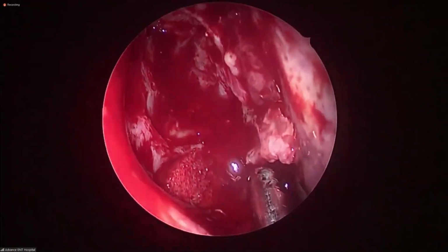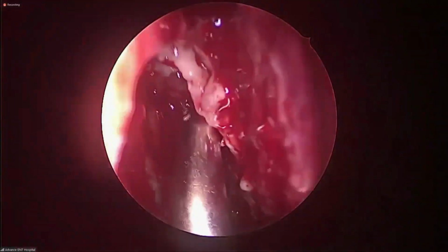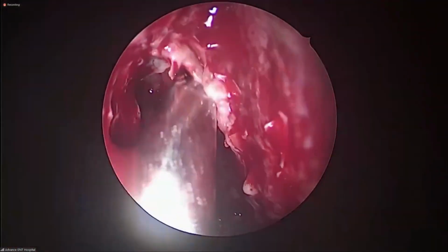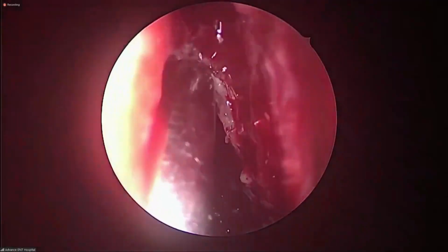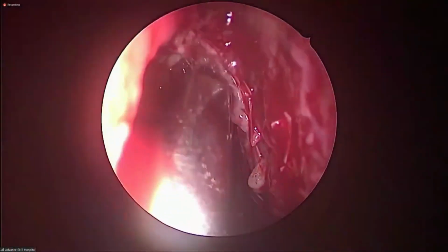The lower part I will take later. Right now, my focus is above. This turbinate is our limit.